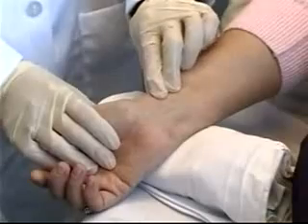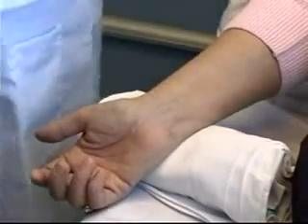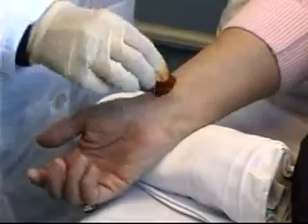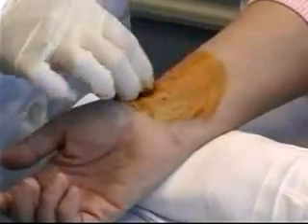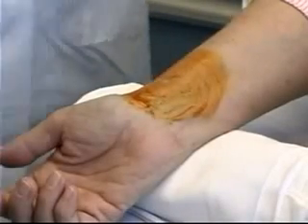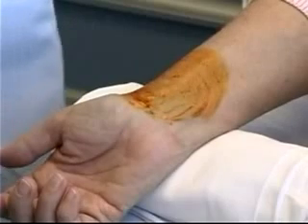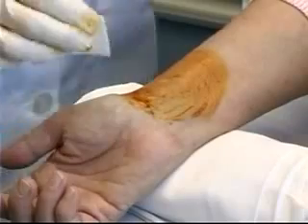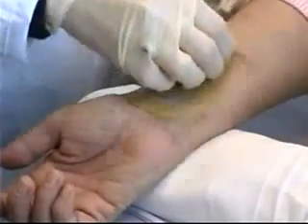Feel for the artery again — it's right there. The first thing to do is clean the area. Start with the povidone-iodine swab, beginning in the middle and cleaning in a circular motion. After allowing that to dry, wipe away the povidone-iodine with an alcohol swab.